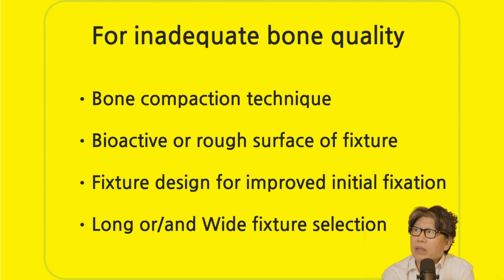If the bone quality is not good, I mostly use the bone compaction technique a lot. I do that almost every day, and then I'll use bioactive or rough surface on the fixture. So the SLOCK implant right now is a nanosurface. This one has a nano SLA structure. So it seems to be sticking a little bit better. It's sticking like crazy.